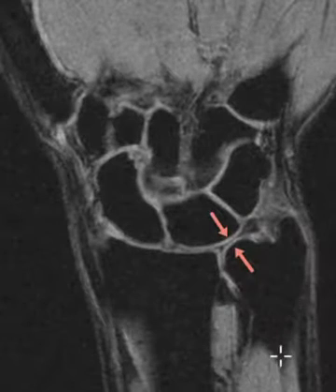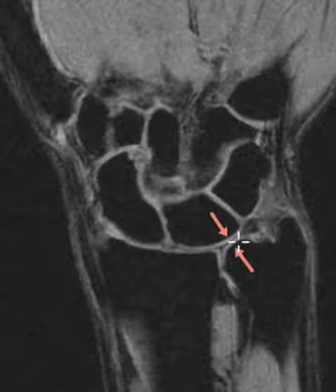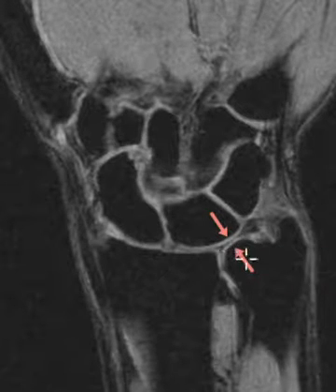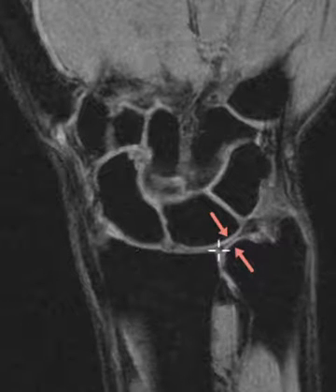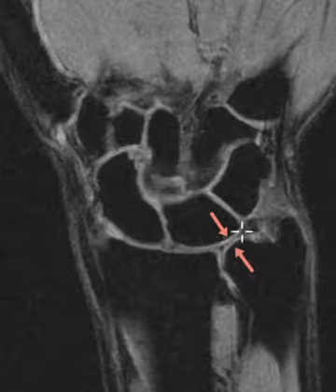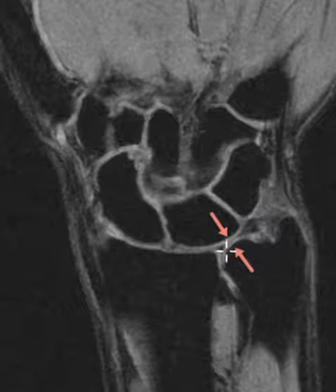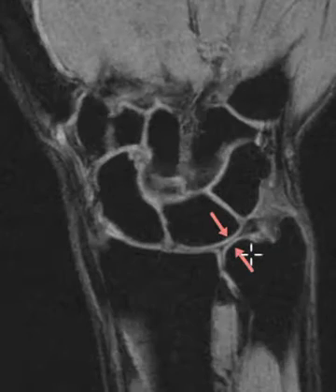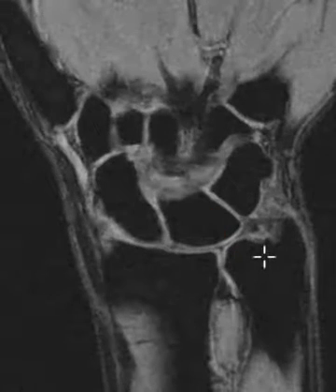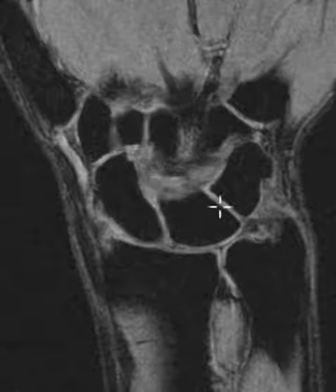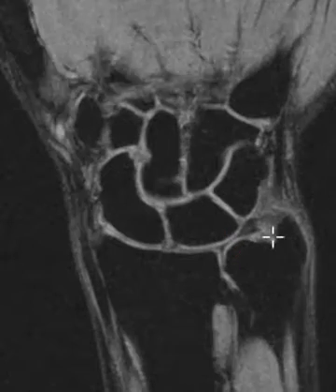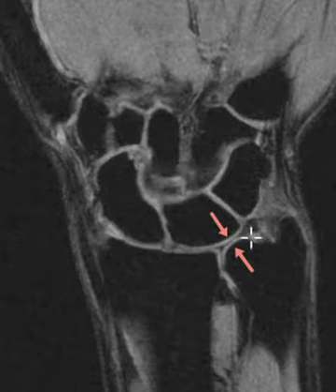The other finding is related to the ulna. This is the ulna, and it goes too far distally — this is a ulnar positive variant. The ulna should end a little bit proximal to the distal radius; here's the radial articular surface. The ulna should end about here because there needs to be room for the triangular fibrocartilage, which needs to come horizontally across. Instead there's no room — the ulna ends at the level of the distal radius. So the TFCC is getting flattened and compressed like a pancake between the lunate bone and the ulna. This is the central disc right there, really, really thin, and surprisingly there's no perforation that I can see.